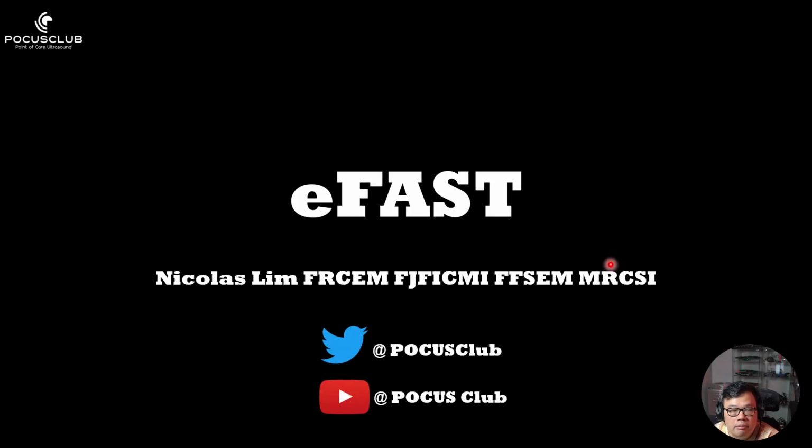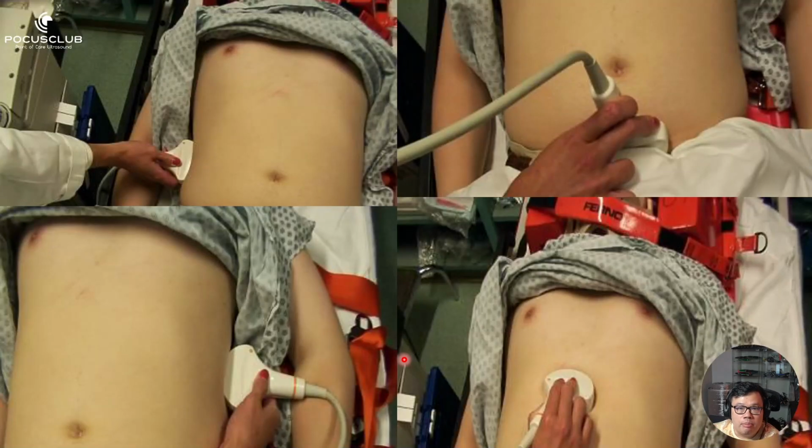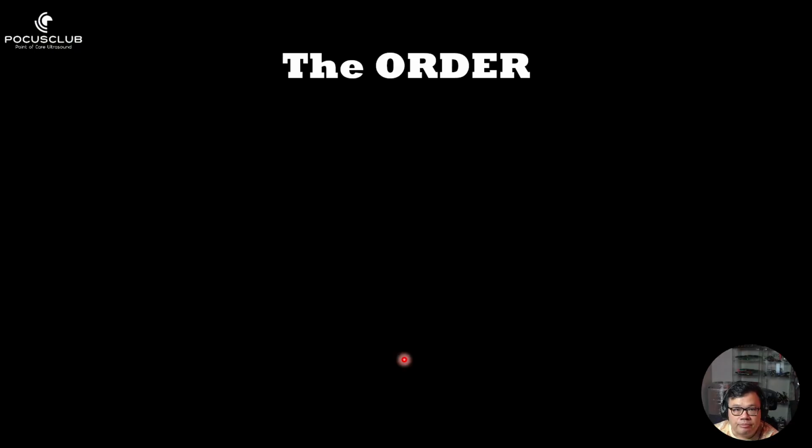So Nick here, let's talk to you about the EFAST examination. So how are we going to do this? Combination of the right upper quadrant, pelvis, left upper quadrant, and subcostal view. And then the thoracic component, which would include the pericardium and pneumothorax.